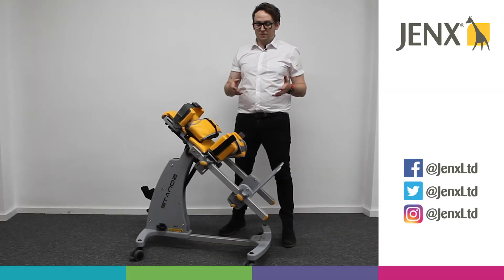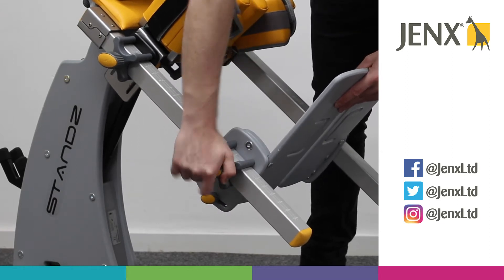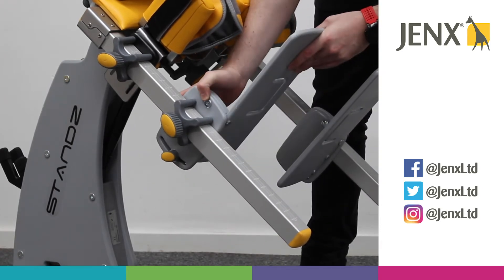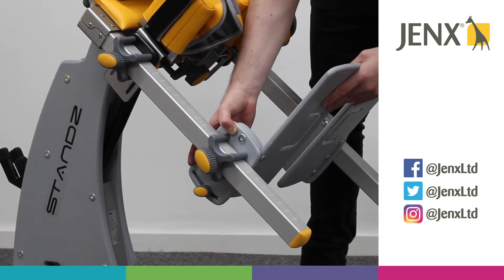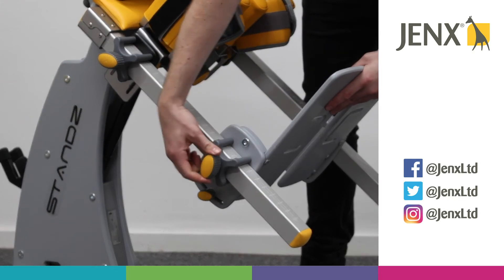To adjust the footplate on the stands, we've got a wing knob on the side here. If we loosen that off, we're able to move the footplate further down or higher up. There are laser-etched numbers on the legs of the stands so that you can ensure you're exactly the same on both sides.